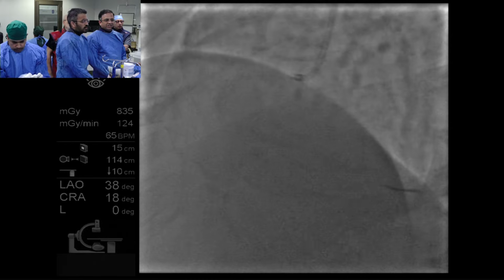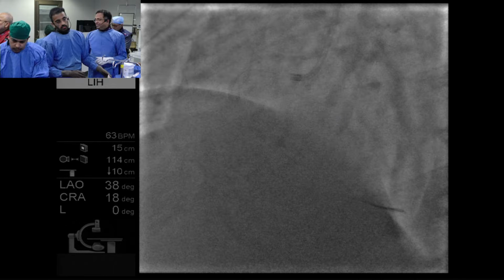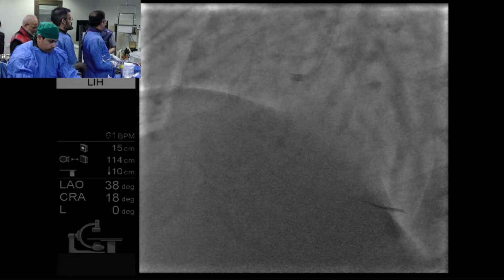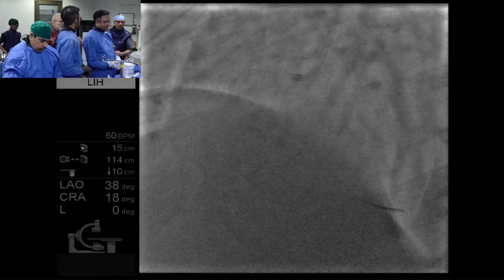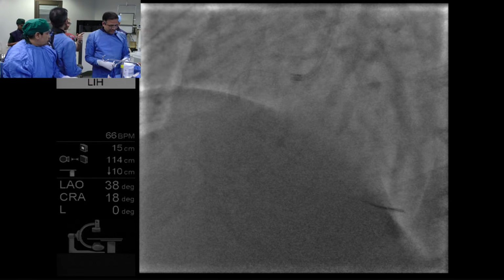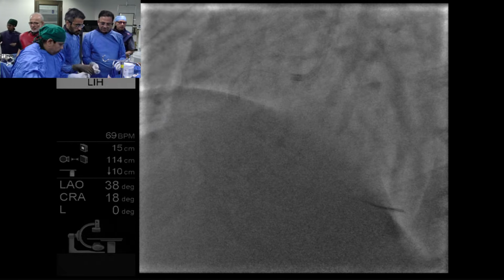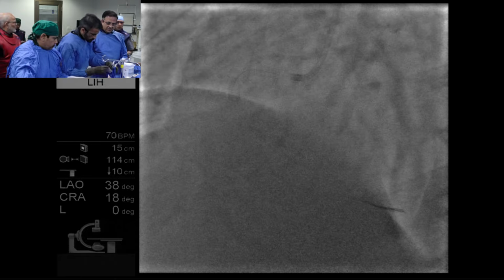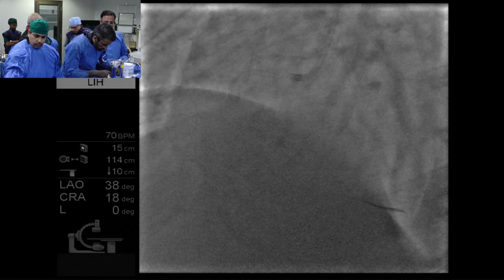We had a question. Should we put the wire in the PL so we get the lead time for OCT? I mean the lead length. But I think this will work. OCT, in fact, you can do IVUS of the distal. Yeah. We are interested in the proximal. OCT. Yeah, for both. Long. Okay. Yeah, it's a pretty long PD.